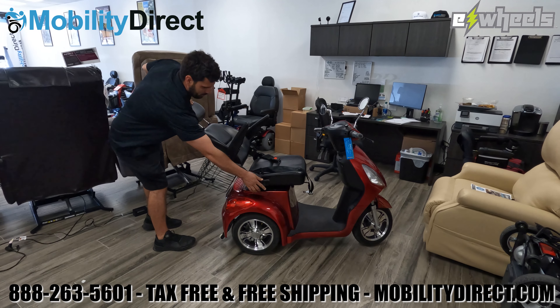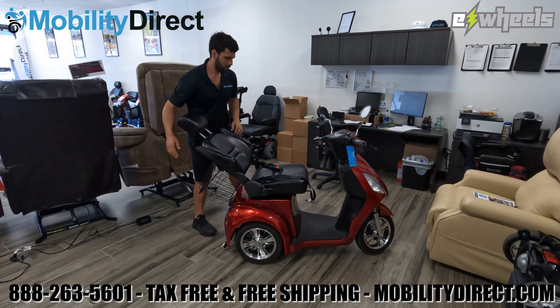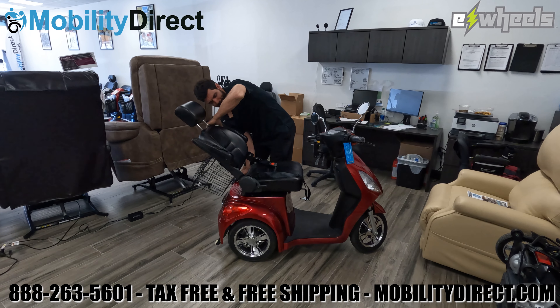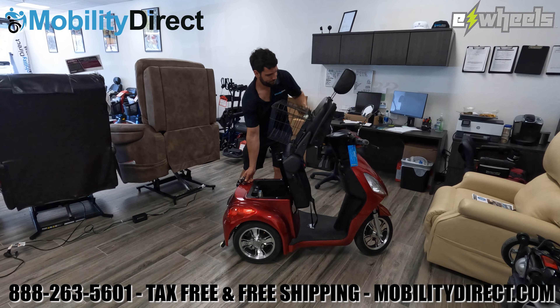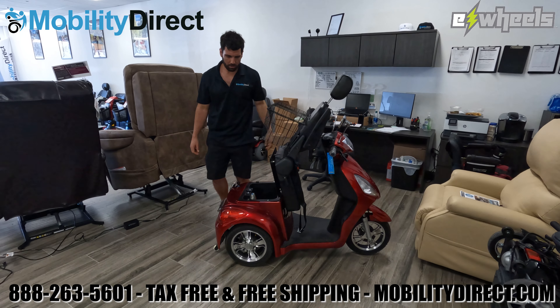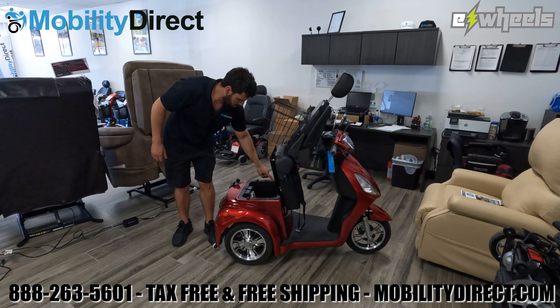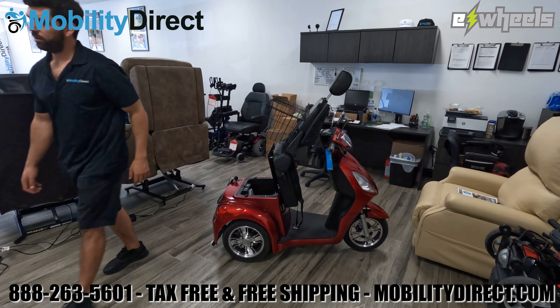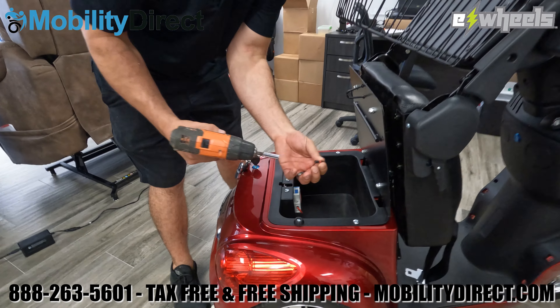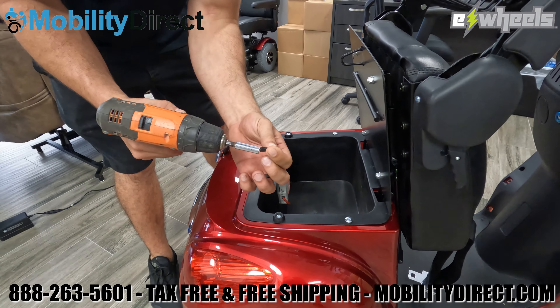The first thing you want to do is recline the seat all the way back as far as it can go and then lift up the armrests. You're going to use the ignition key to lift the seat up and access the storage compartment. If you don't have the seat tilted all the way back and the armrests flipped up, the seat won't tilt forward enough for you to access the screws and it'll make it difficult to remove the storage container, which you'll have to remove.